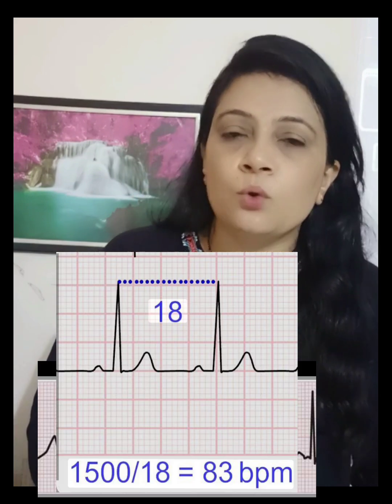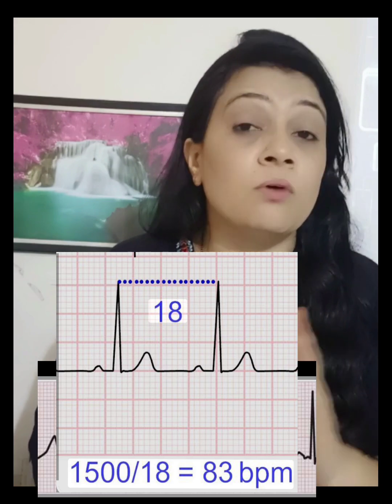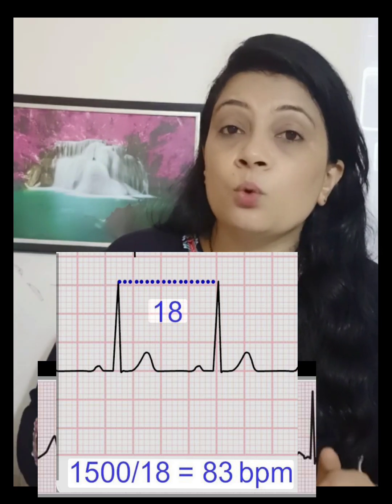Now calculate the heart rate. Heart rate is calculated differently for regular and irregular rhythm. For a regular rhythm, there are two ways: with small squares or with large squares. With small squares, the formula is heart rate equals 1500 divided by the number of small squares between two consecutive R waves. With large boxes, heart rate equals 300 divided by the number of large boxes between two R waves.